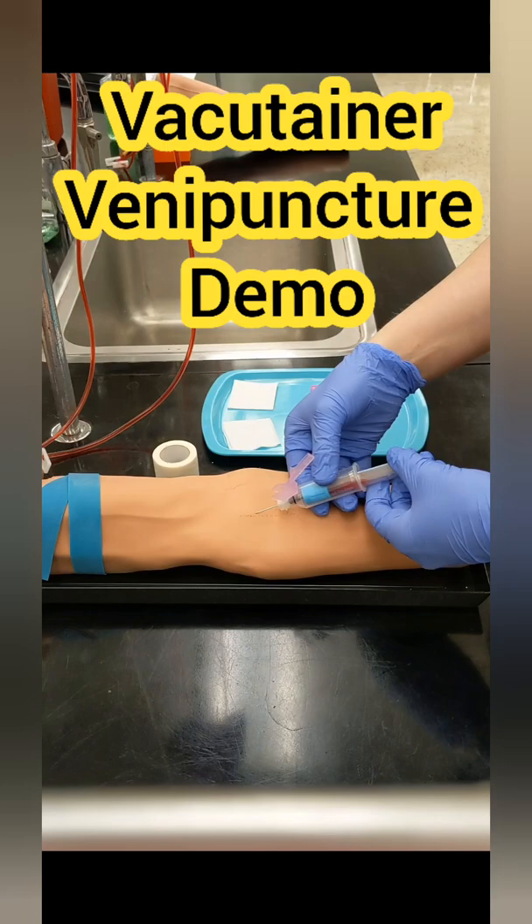Welcome to this Vacutainer demo. This is going to be a bit of a quicker one with some subtitles.